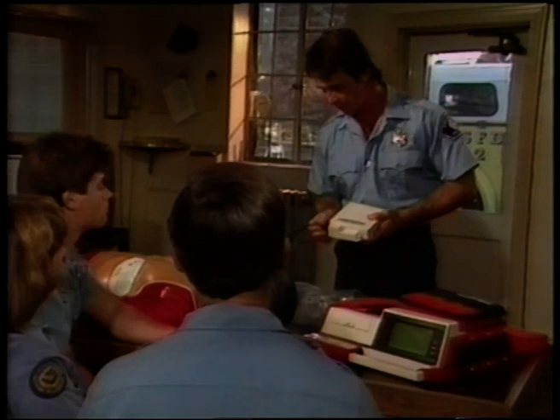To charge a battery, plug the AC charger into an acceptable active power outlet. The green light on the left indicates proper connection. Next, plug the charging cord into the back of the battery. The green light on the right indicates that the battery is being charged at a fast rate. When the green light on the right turns off, the battery is not necessarily fully charged.